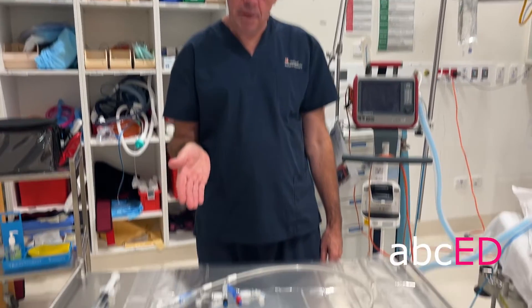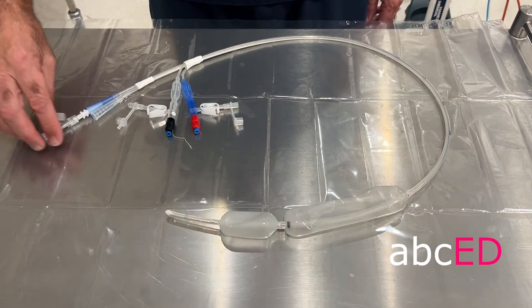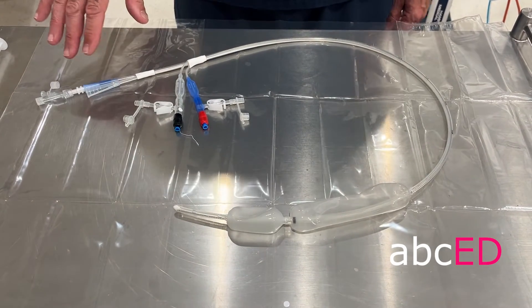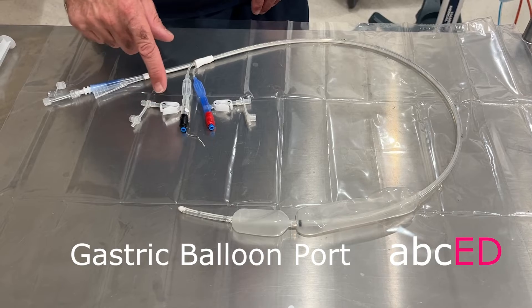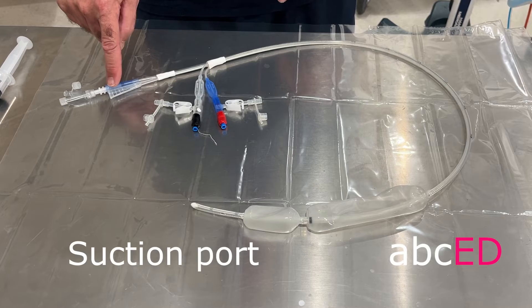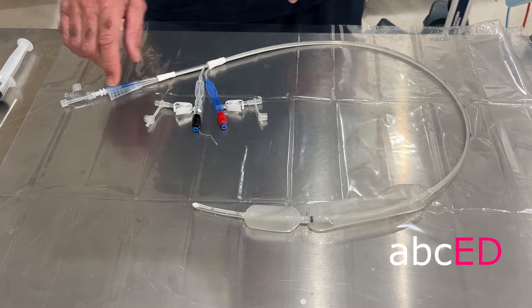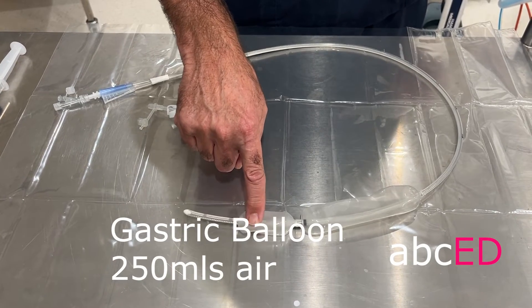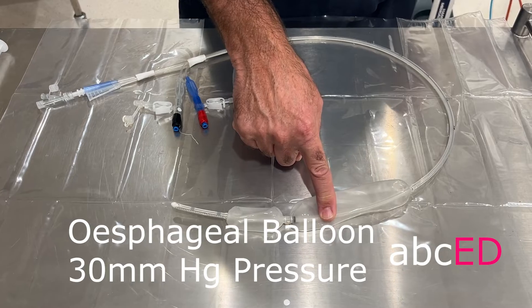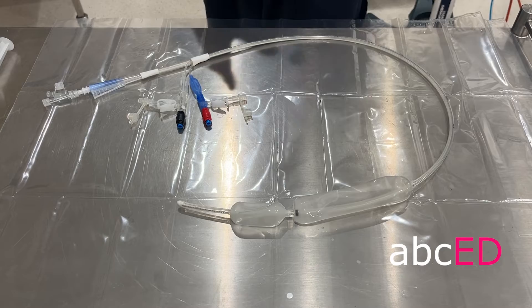This is the tube and you'll see it's a multi-lumen tube. Our Sengstaken-Blakemore tube has a guide wire — they don't all have guide wires, but all of them have similar features. They'll have a gastric balloon and esophageal balloon. These have got two sampling ports, a suction port, and a guide wire port. The gastric balloon takes 250 millilitres of air, and the esophageal balloon, if you need to insert it, you'll inflate it up to 30 millimetres of mercury, so the actual volume is variable.